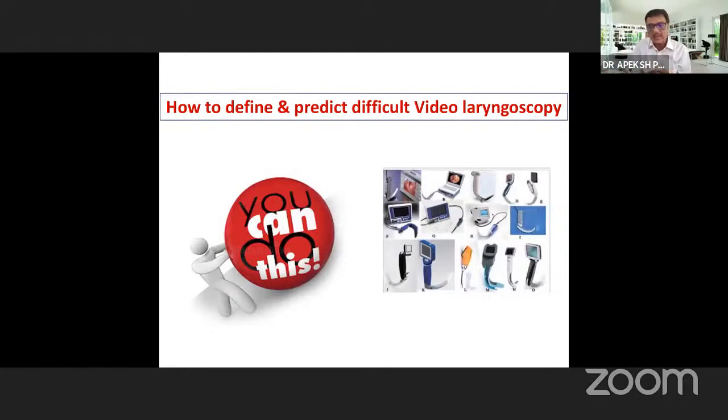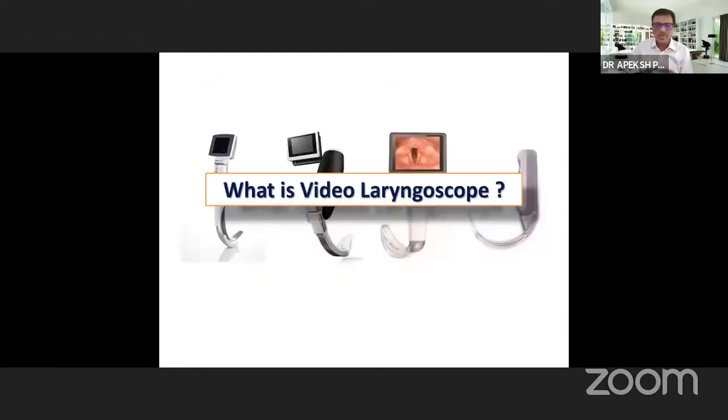What are the criteria there for predicting difficult laryngoscopy? Those are there for the laryngoscopy, not for predicting the difficult video laryngoscopy. So we need to define that criteria. To understand that, we need to understand what a video laryngoscope is.